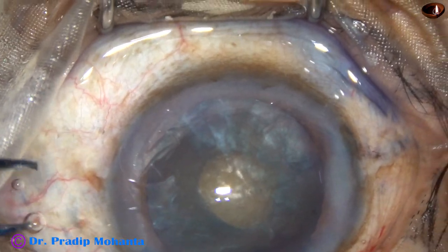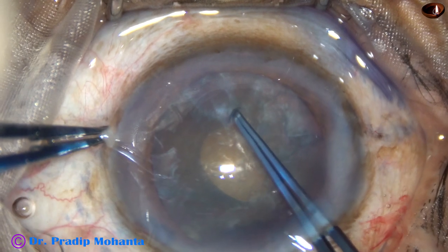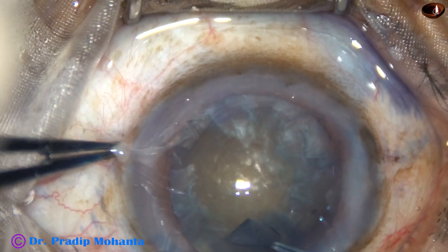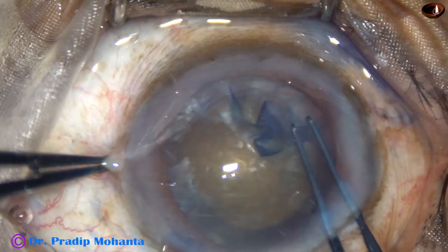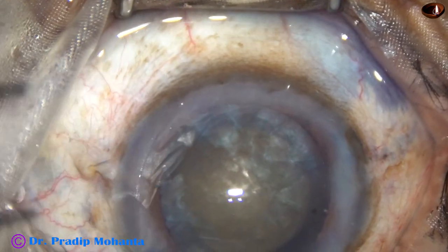...Vannas scissors are used to make a cut at the margin of this mini rhexis, and then the utrata forceps is used again to enlarge this mini rhexis into an optimum-sized capsulorhexis. The CCC is done and this is a fairly round rhexis.